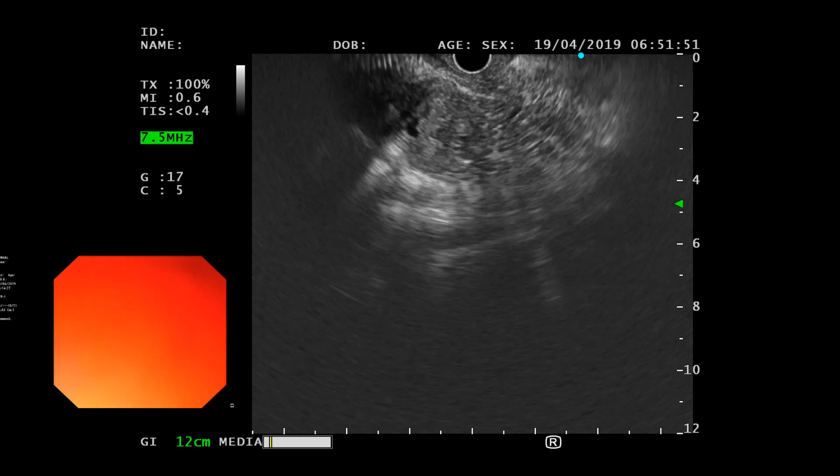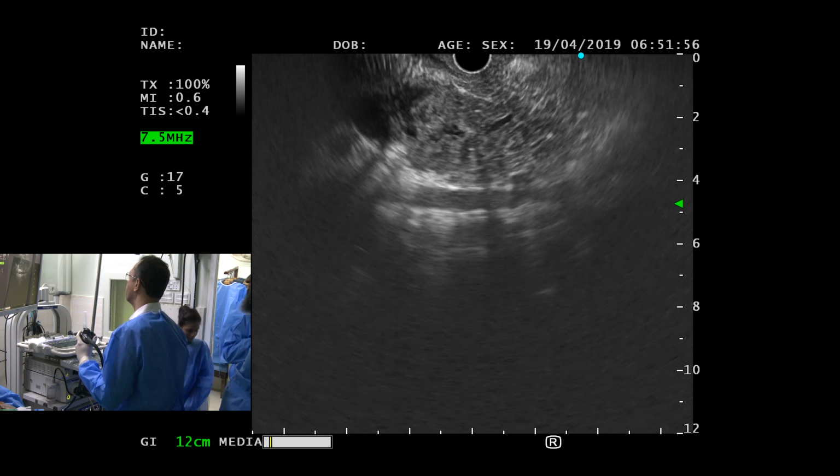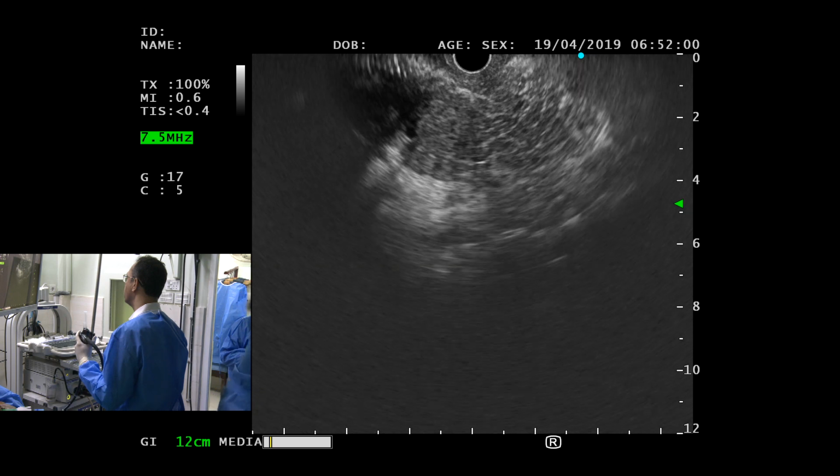No, it's not just, you see, somebody is paying. Yeah, that's not true that it's free of cost. No, what I mean here is the patient is not burdened. But okay, I agree with you that obviously every time we use a needle, somebody has to pay.